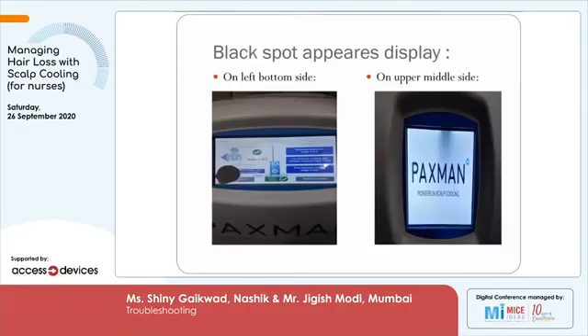In one place, the chemotherapy drug had spilled on the screen, and we got a complaint that the screen had a black blob. On the right side above the word Paxman, you can see a lot of blackening in the top corner. You have to protect the screen — this is a touch screen with active input. You should not allow any kind of liquids to be spilled on the screen. If such a thing happens, decommission the machine and call the engineer.